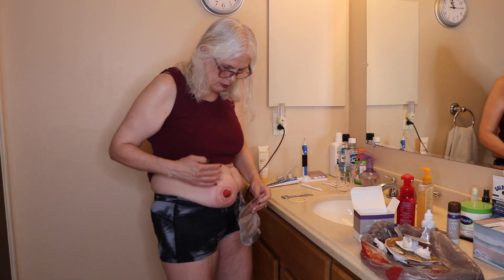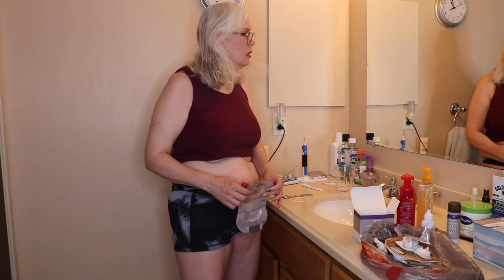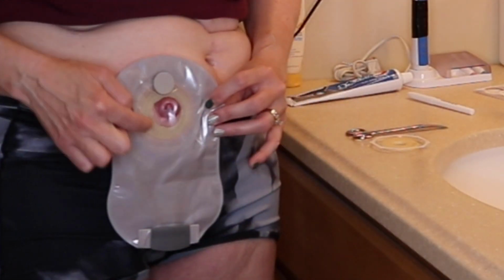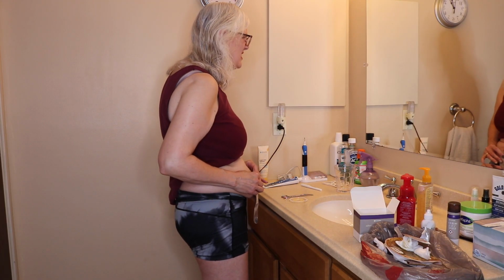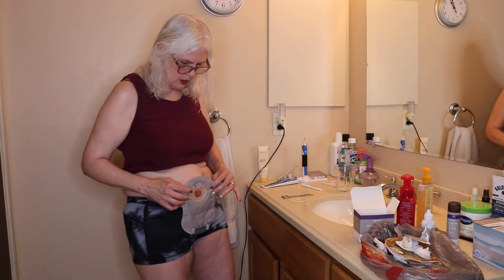So, I'm feeling some gas. Okay, so the next thing I do is with my bag, I will hold it up to here and make sure that I can see my ostomy all the way through. So I do that on the mirror. Oh, there we go. Yeah, so that'll be fine.